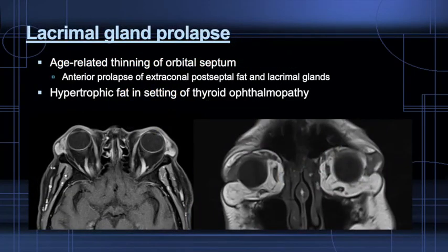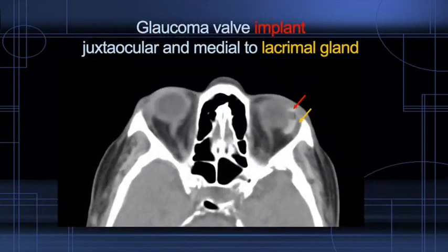Here is a case of prolapsed lacrimal glands, which accompany prolapse of extraconal post-septal fat. This is seen in the setting of aging and thinning of the orbital septum and with overall excess fat deposition, and can be seen often in the setting of thyroid eye disease. Finally, a frequent incidental finding seen at the lacrimal region is a glaucoma valve implant, not to be mistaken for pathology.